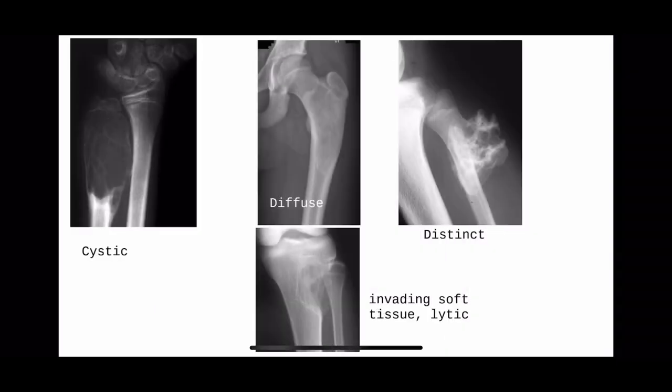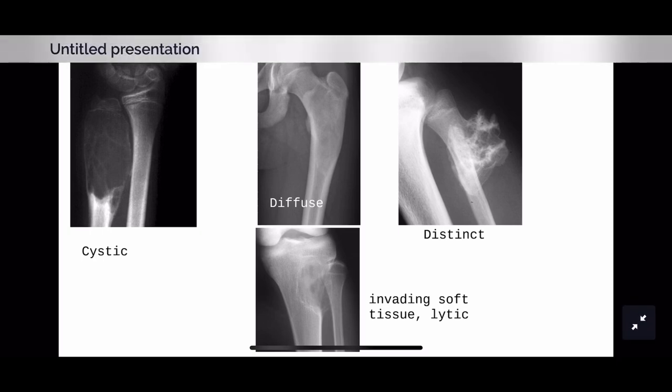Some more examples. This cystic lesion is not in the epiphysis and looks ballooned out — must be ABC, aneurysmal bone cyst. This is a diffuse lesion — first word: diffuse — should be Paget's disease or fibrous dysplasia. It is altering the shape, going into a shepherd's crook deformity of the proximal femur — so it has to be fibrous dysplasia, not Paget's disease. This is a distinct lesion — osteochondroma, because you can see it is arising from the bone.